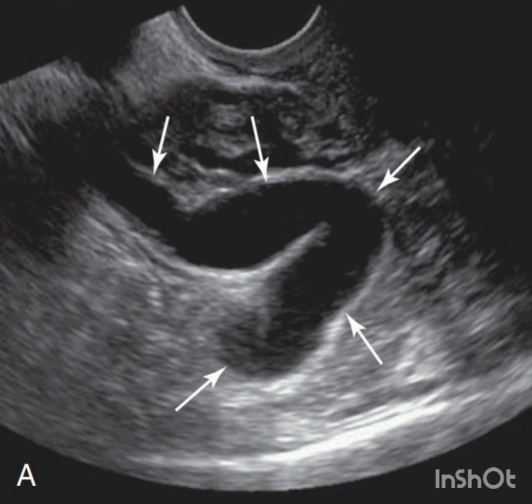The differential diagnosis for a tubal structure in the adnexa includes blood vessels, ureters, and bowel loops. Blood vessel will have blood flow on color Doppler. A bowel loop will have peristalsis, and a ureter can be distinguished as it will be going towards the kidney. It will have an upward direction.